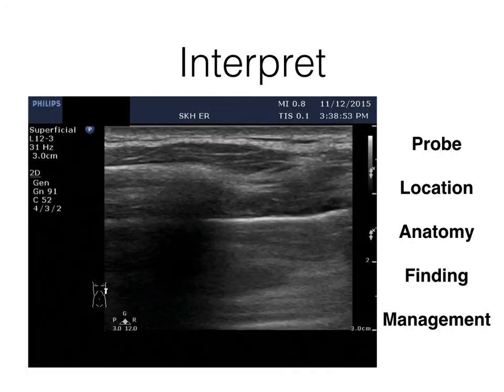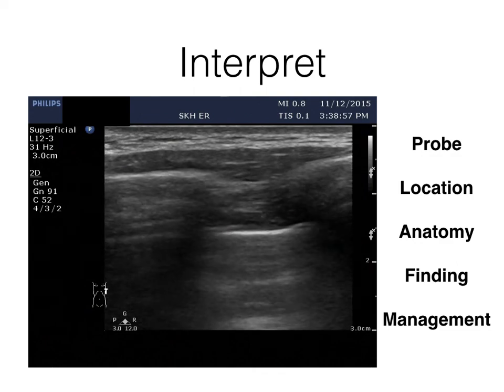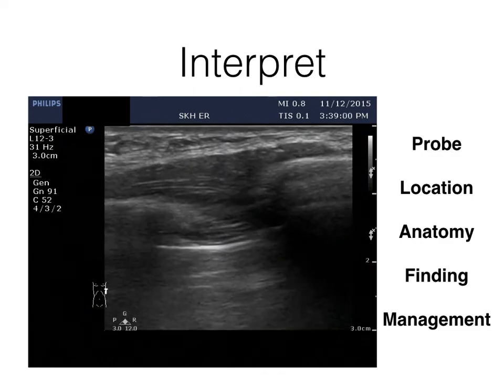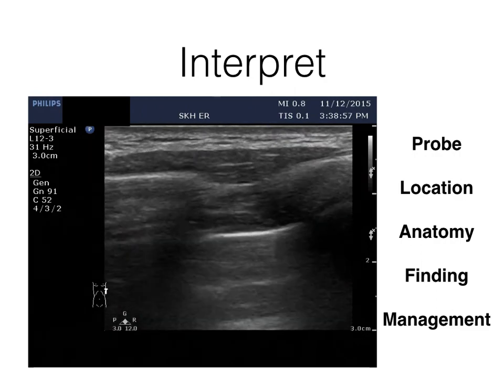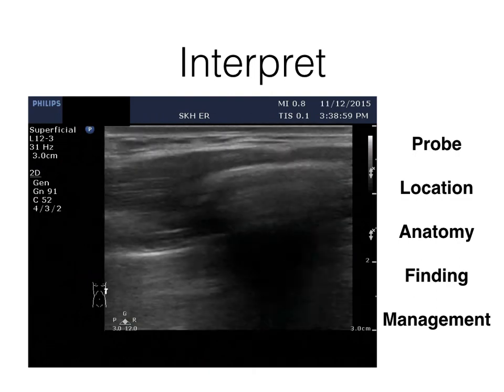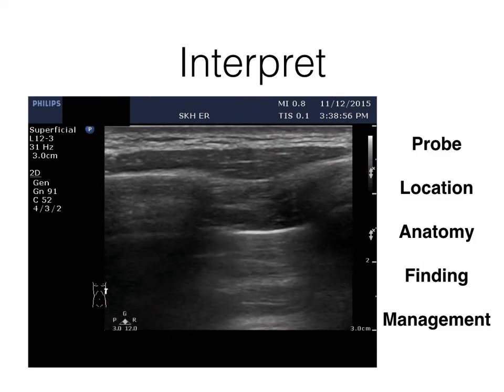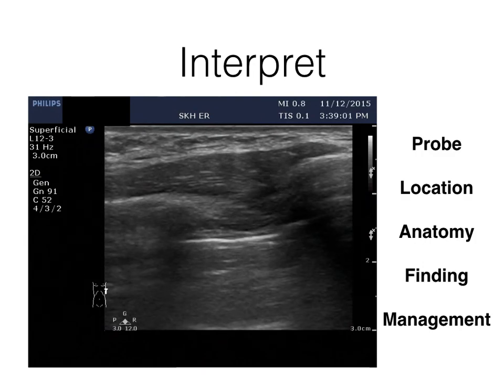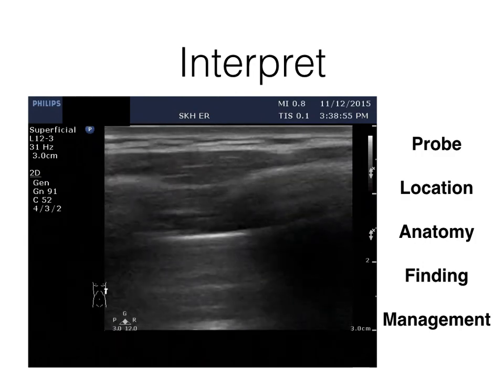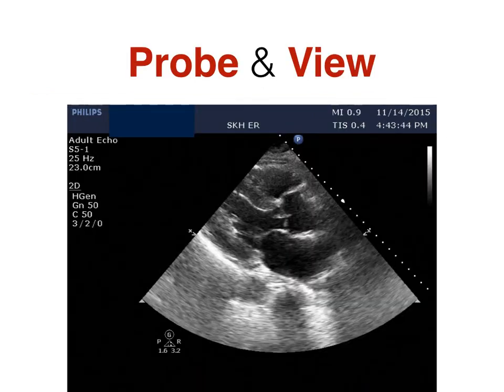After the intubation, after the pigtail insertion, we can also monitor the response from the lower part to the upper ribs and even the one above. Sliding, pulse. And then the lung point, and then no sliding. I would like you to observe this. This is not actually lung pulse. It's a kind of expansion, touching, then disappearing, touching and then disappearing. Okay, still some kind of variant of the lung point.